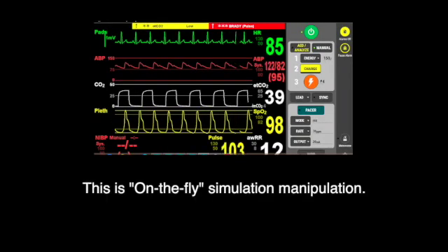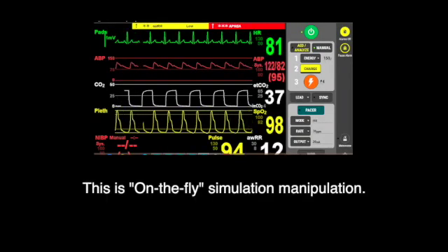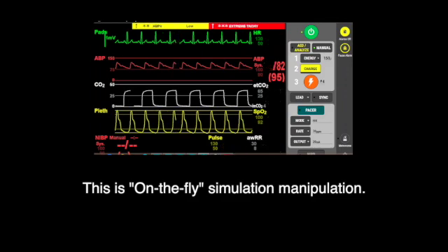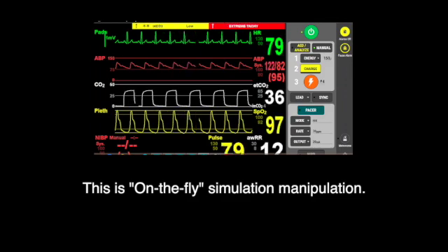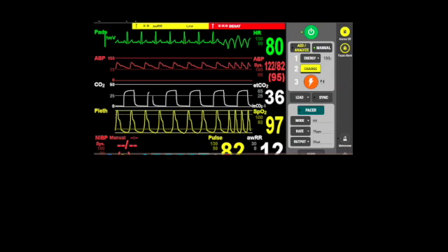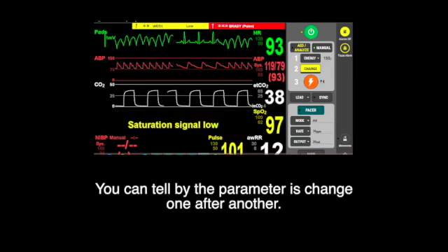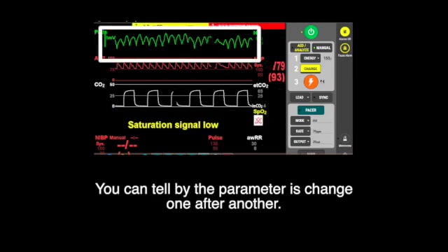Demonstration of on-the-fly manoeuvre with LIBTS instructional application. This is an on-the-fly simulation manipulation. You can tell by the parameters — they change one after another.